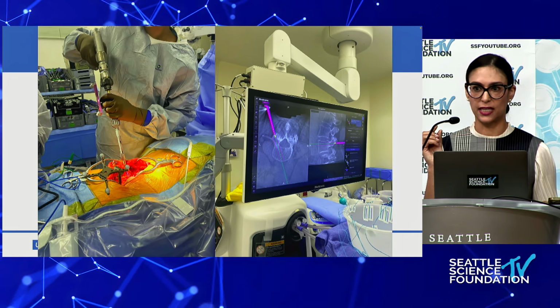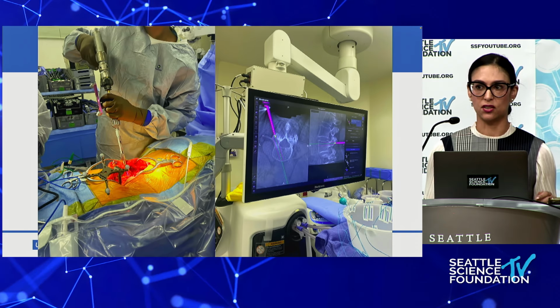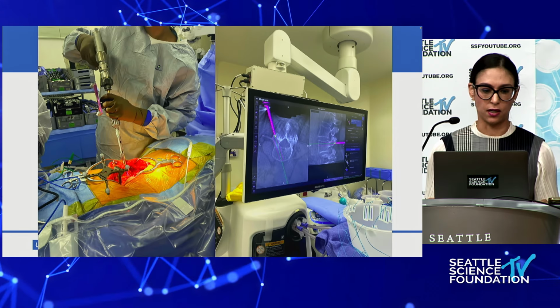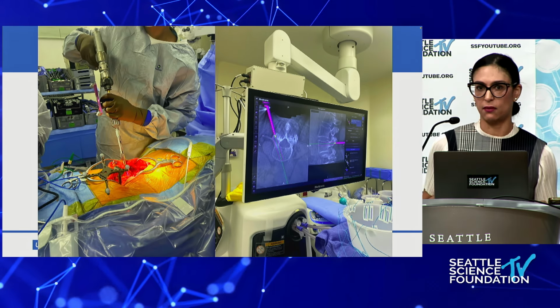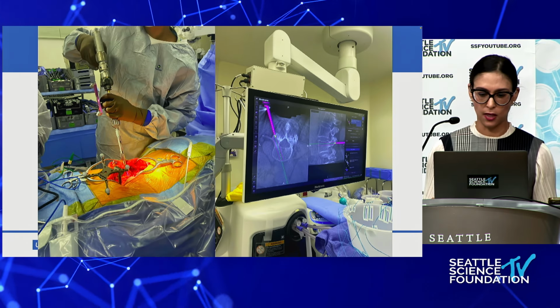They essentially have a little stylet that goes out through the screw head, and you can use that, again, with the haptics and mechanical feel to find that little crater that you made. I do it on power to save myself, and I try to keep my arm close to my body, but sometimes it gets up.